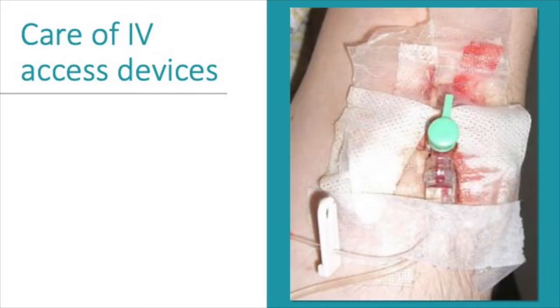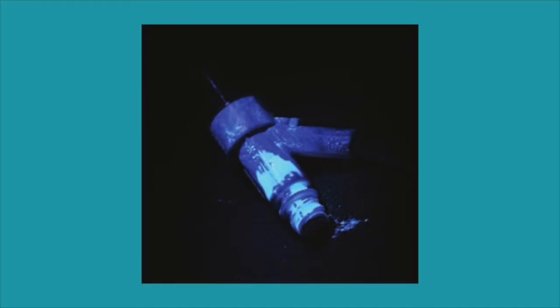Care of IV access, so before you do anything with your IVs, making sure that it is cared for properly, that there's no signs of infection and possibly no signs of swelling as well. You may not see it, but it may be there.